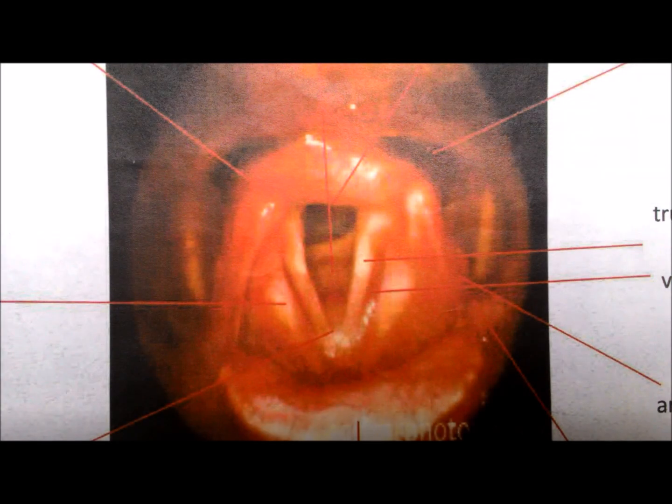In this video, I'm going to show the anatomical landmarks of FEES. FEES is fiber optic endoscopic evaluation of swallowing. In this exam, we observe directly the movement of structures during the function of swallow. So, this provides a precise and objective evaluation of swallow.